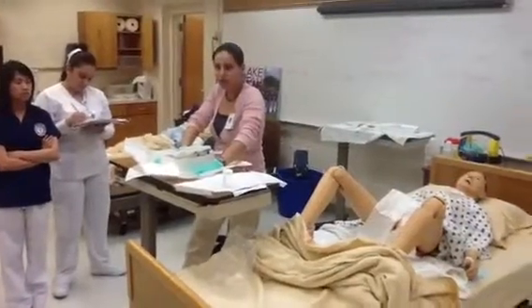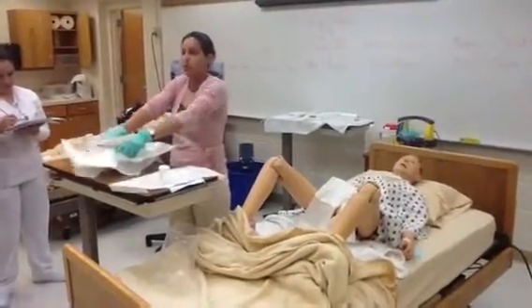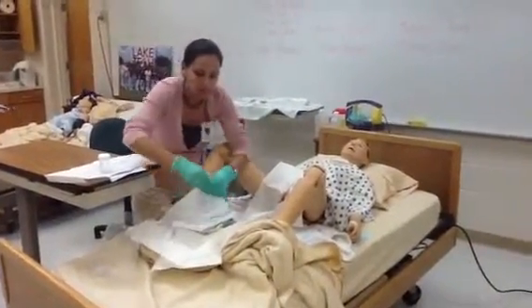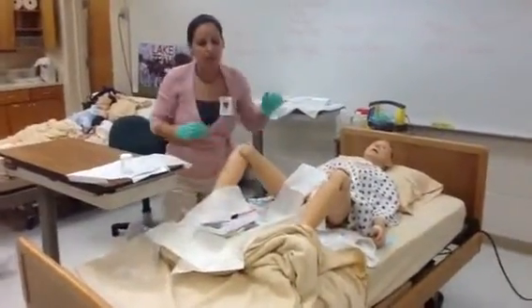Into a position that's good for my patient, or I can take this entire sterile field, not reaching under, but reaching above, and manipulate it next to my patient. Okay? Do that. I'm going to open up my swabs, make sure that I can reach them.